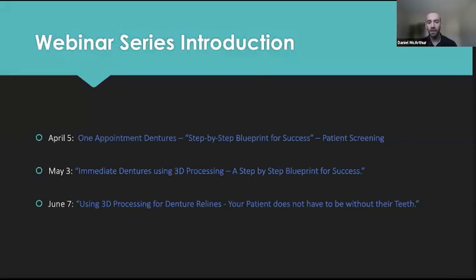One more here. Can you go straight to a try-in versus going with a wax rim bite block, and with or without photographs? Yeah. I'm going to be honest, I haven't done a patient who hasn't had dentures in a long time, but yes, that would be an option. Go to a try-in, use that as your bite blocks.